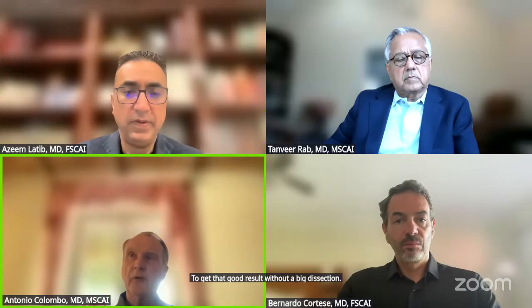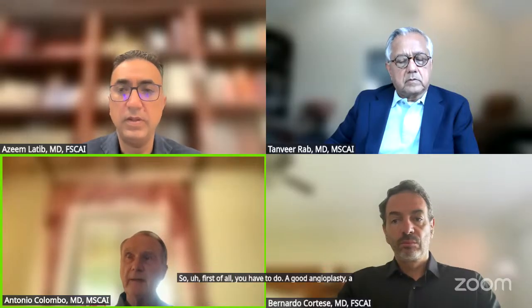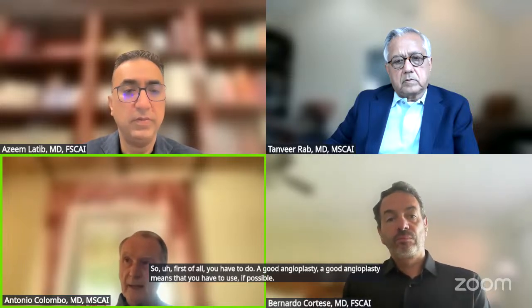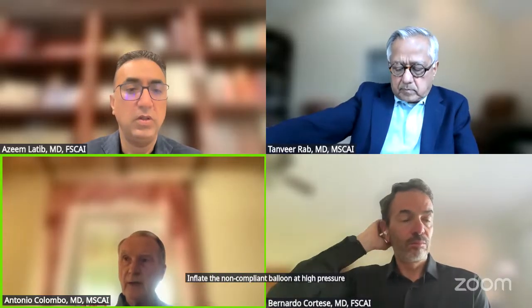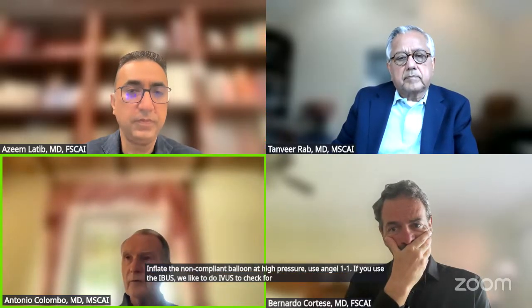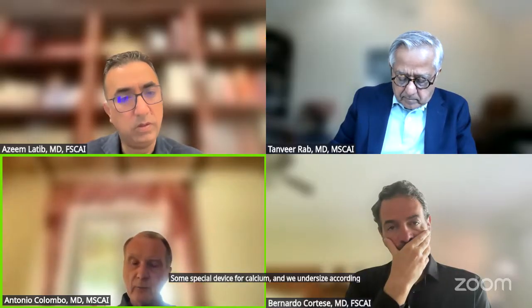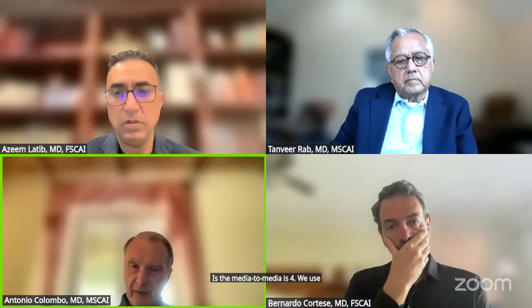So first of all, you have to do a good angioplasty. A good angioplasty means that you have to use, if possible, a non-compliant balloon, inflate the non-compliant balloon at high pressure, use angio 1-to-1. If you use IVUS, we like to do IVUS to check for calcium, know if we need some special device for calcium, and we undersize according to the media to media. If the media to media is 4, we use a 3.5 high pressure balloon.